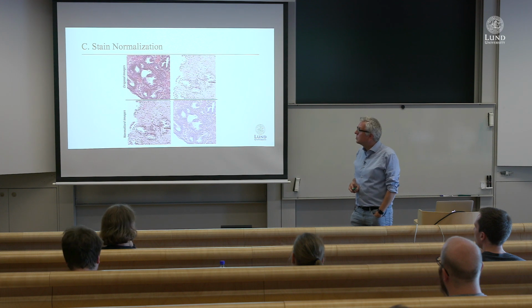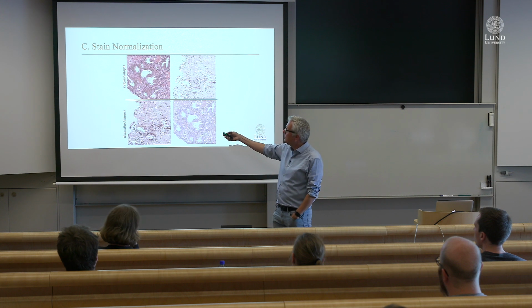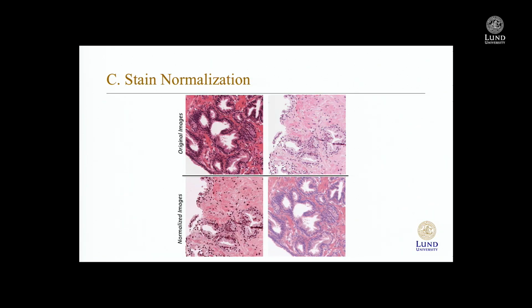And then we've also tried different standard methods for trying to normalize the images just by changing the color, so the color correction. So these are more like image processing type of methods.